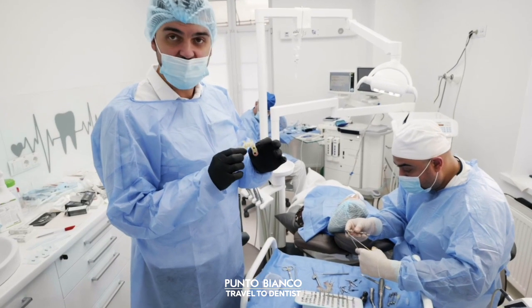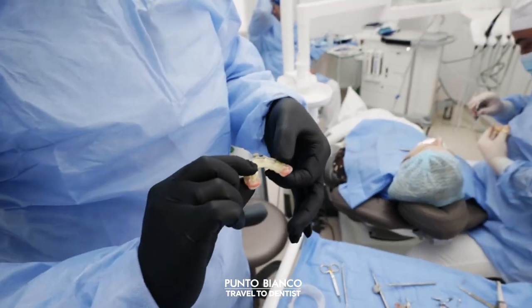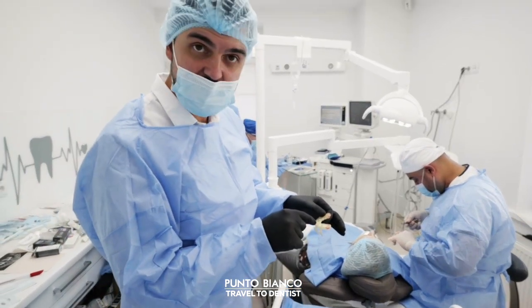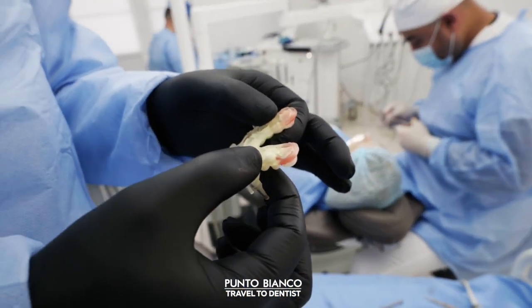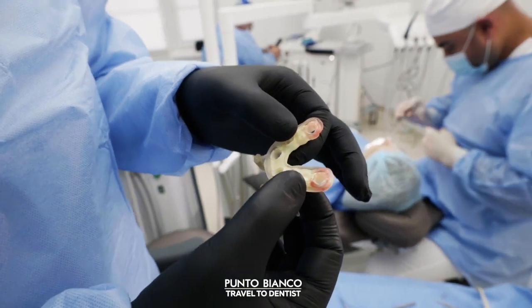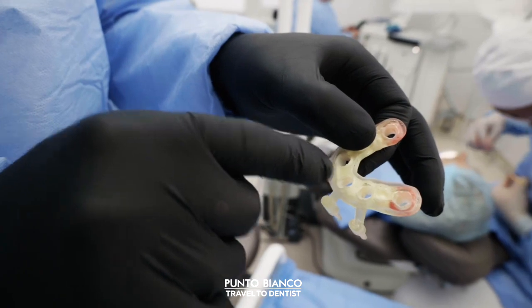With this positioning, in which the prosthesis is placed the same way as shown in the fixing guide, we were able to visually check and verify if the holes in the prosthesis and the position of the multi-units coincide with each other during the examination. At one of the implants we positioned, there was a minor variance, so now the surgeon will modify the multi-unit and adjust the angle in order to ensure a perfect fit within the denture.